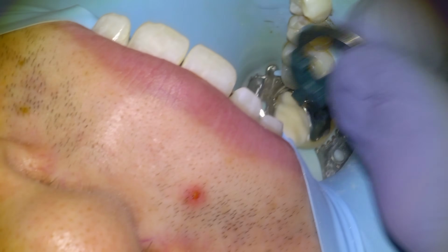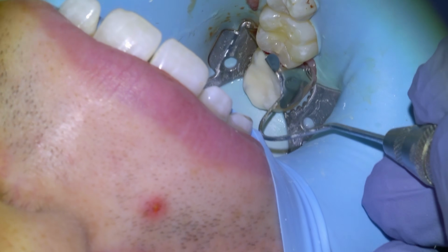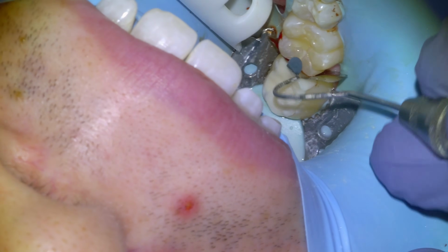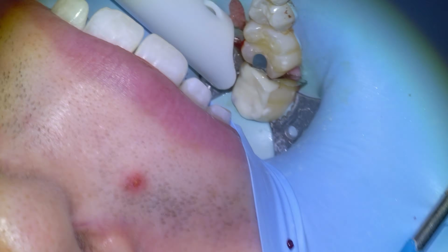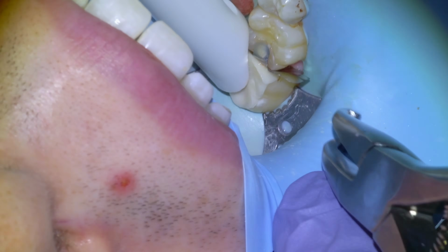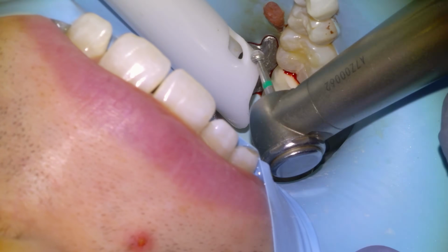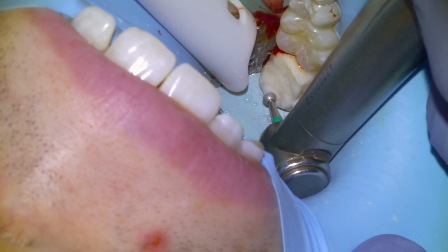And then I'll literally give about 4 minutes. I'll walk away from the room and have a sip of coffee while the Equia Forte sets, and then go back, because Equia Forte really does need time. And if you don't give it enough time, then when you're removing the sectional matrix, the marginal ridge can crumble and you have to redo the whole procedure. So I've learned that lesson the hard way, and now I wait 4 minutes, especially with these bigger restorations.